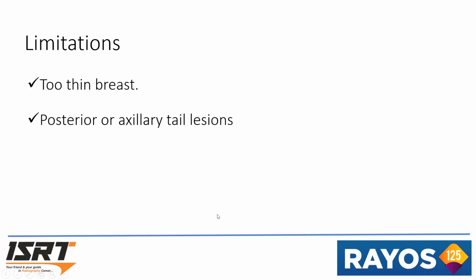Next are the limitations. A number of potential problems can occur with the stereotactic prone biopsy. These include negative stroke margin in case of a thin breast. The same problem arises in patients with lesions that lie close to the distal skin surface.